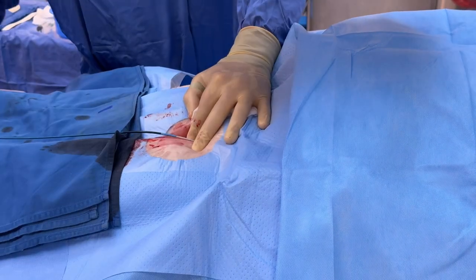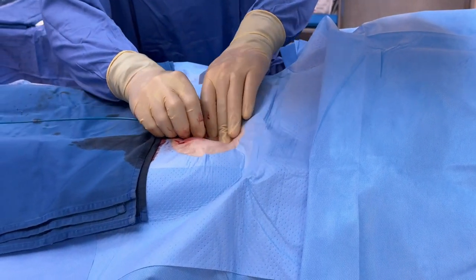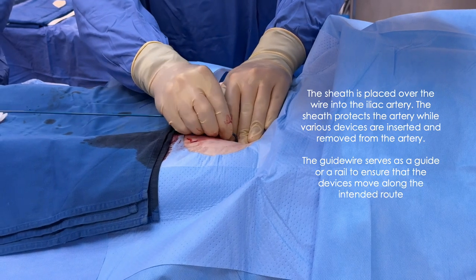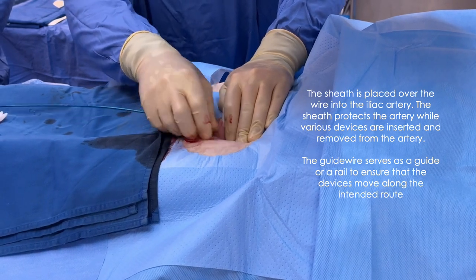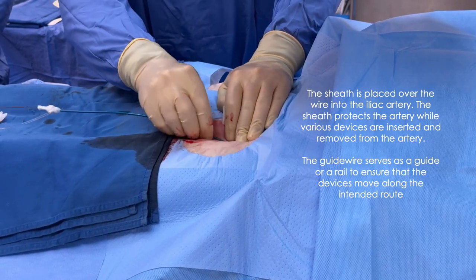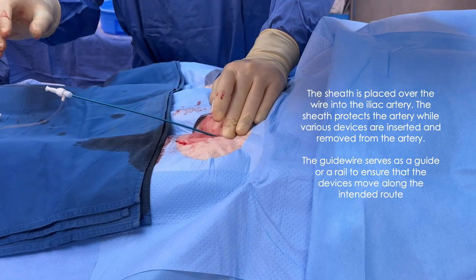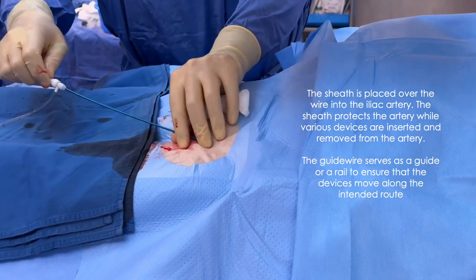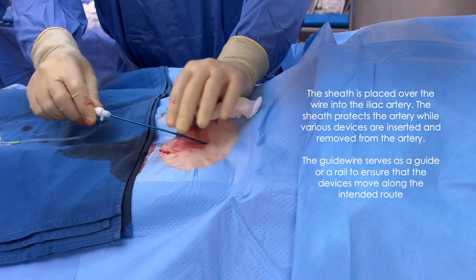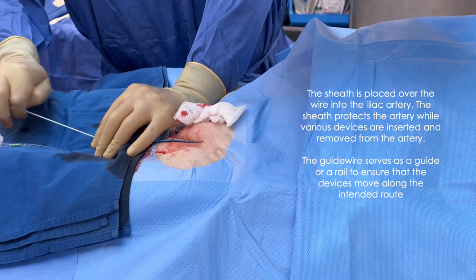The sheath is placed over the wire into the iliac artery. The sheath protects the artery while various devices are inserted and removed from the artery. The guide wire serves as a guide or a rail to ensure that the devices move along the intended route.